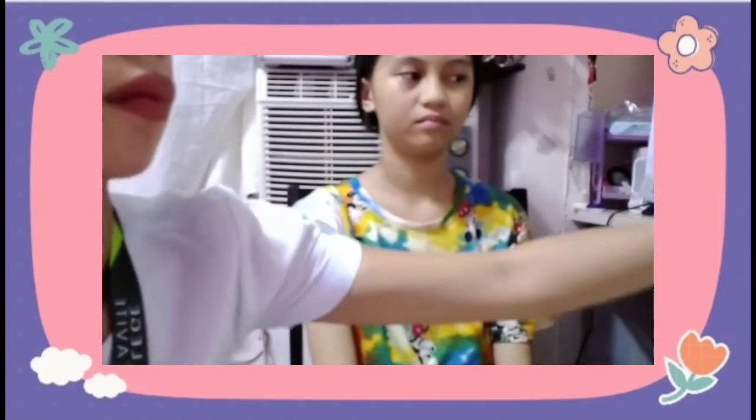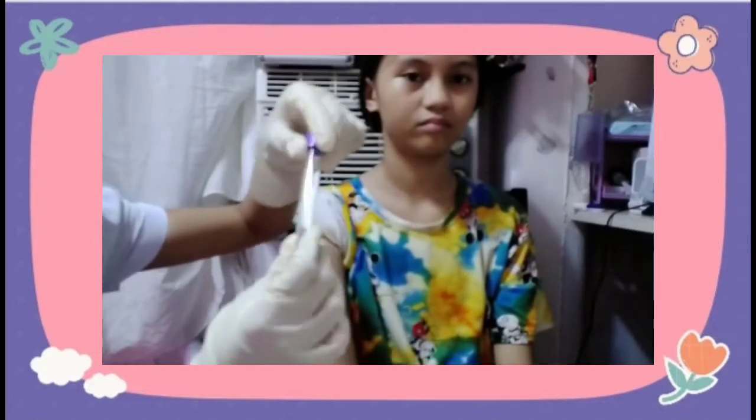Now I'm going to open a specimen tube and place the cap upside down on a firm, dry surface so that the inside will not become contaminated, or if the swab is attached to the lid, use the cap to loosen the swab. Hold the tube in one hand and take out the swab.